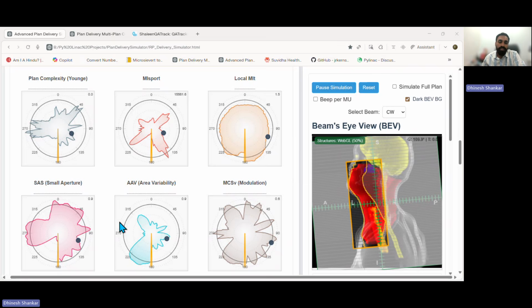From a research point of view, the direction is completely different and it is limitless. We can compare the complexity versus GPR, time versus accuracy. We can expand the idea and the logic behind the plan complexity metrics, and it gives very powerful planning insight.